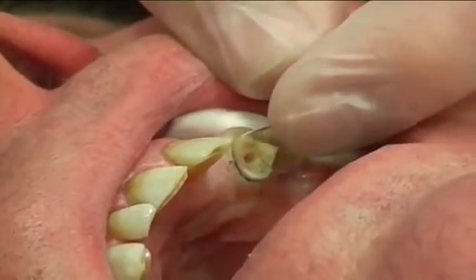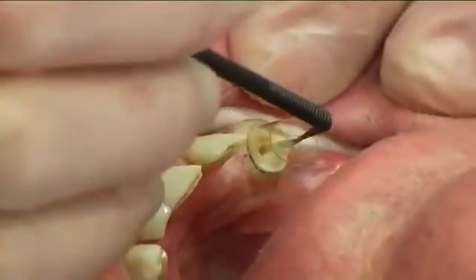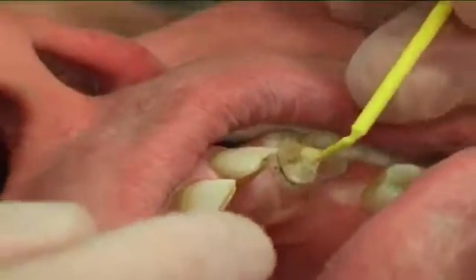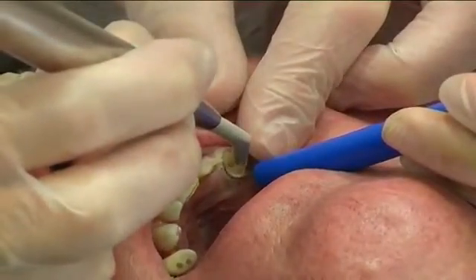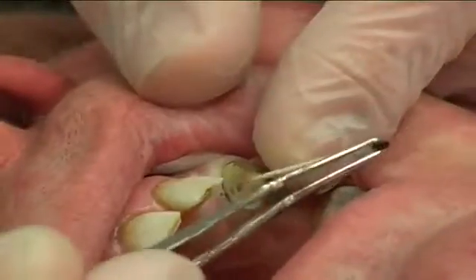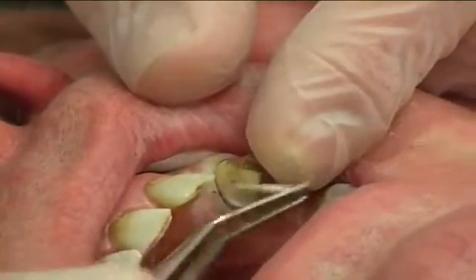The core matrix was placed and the root canal was bonded according to the cement manufacturer's instructions. Prior to cementation, an activating resin layer was thinned by carefully blowing the surface of the post with dry, oil-free air. The resin was then light cured thoroughly for 10 seconds.